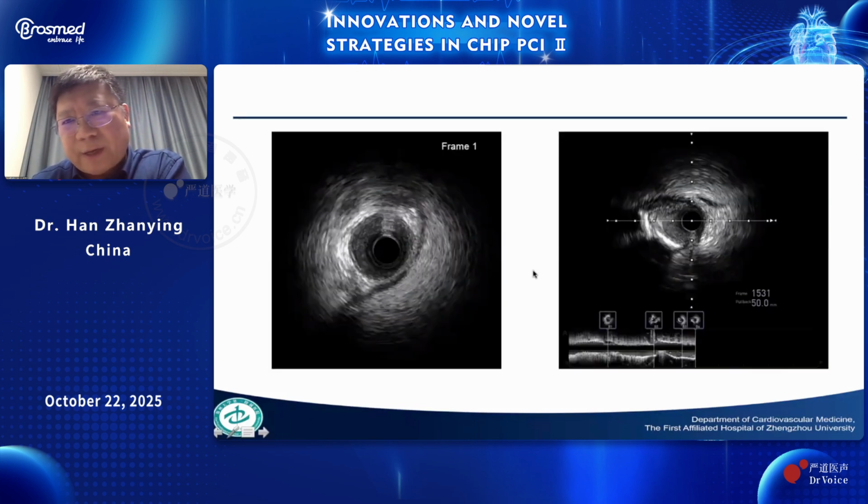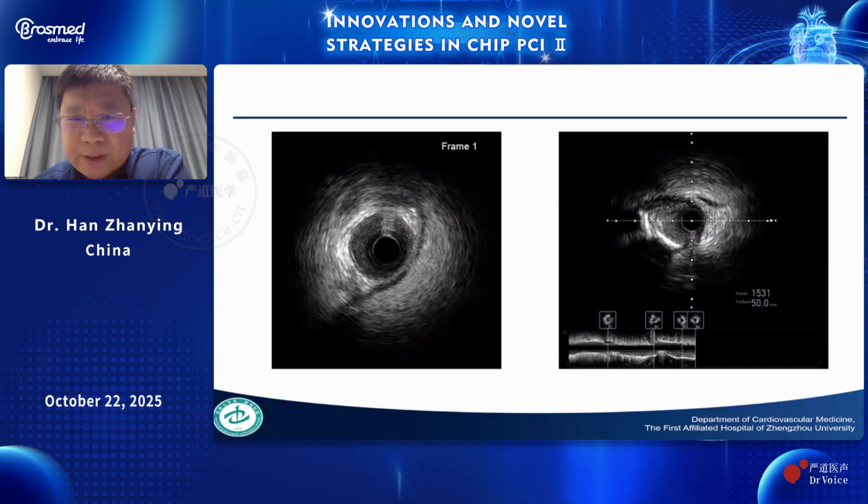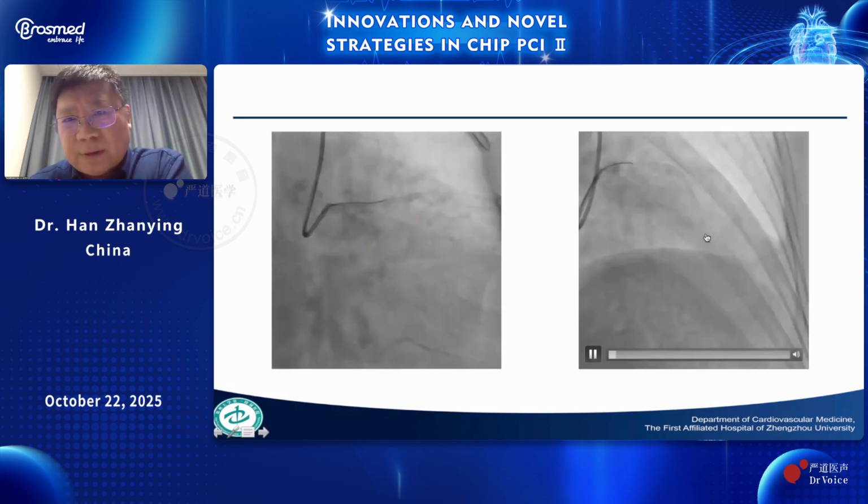And we check the area. It's nearly 3 millimeters square. And I think, according to the guideline for vessels, especially the LAD, if the diameter is less than 3 millimeter, then an area of 2.4 millimeter square is okay. So we didn't treat because this patient's clinical symptoms have maybe been relieved.